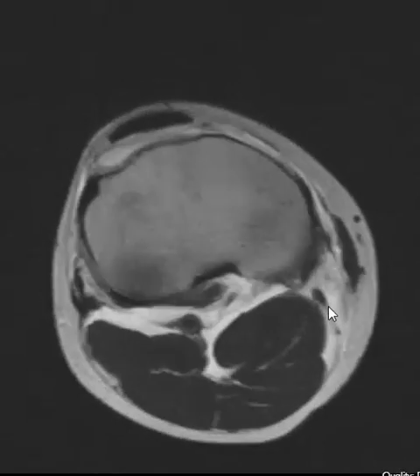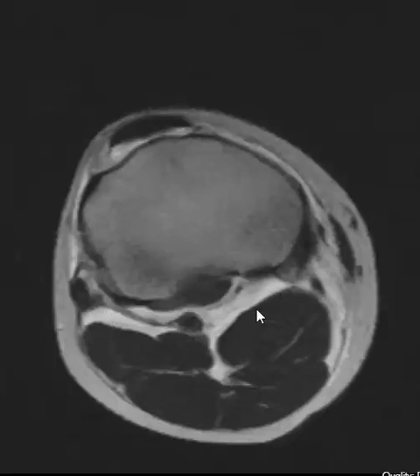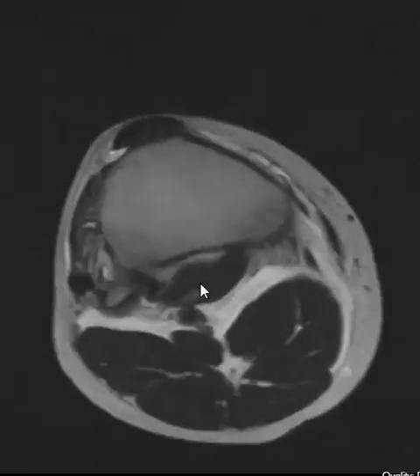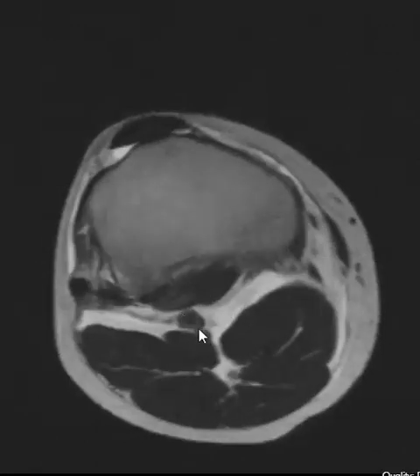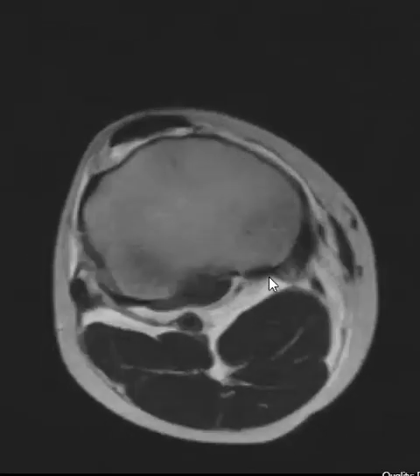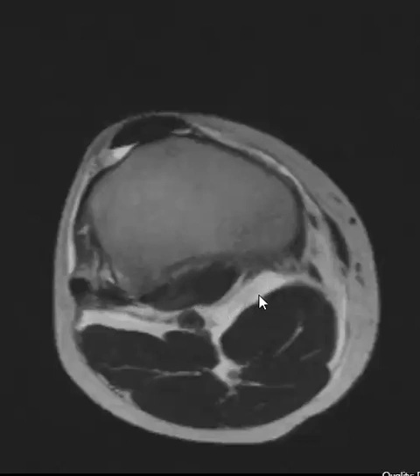We're going to go down a little bit further. Now we're on these T2-weighted images — fluid is bright. We see something very abnormal back here. You see the gastrocnemius muscles, we can see the popliteus muscle here and we see the popliteal artery here. You see this band around — this is fluid in the posterior deep space of the knee. Why is he having all this fluid back there?